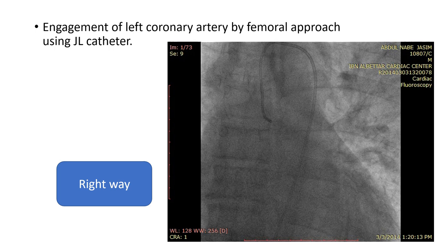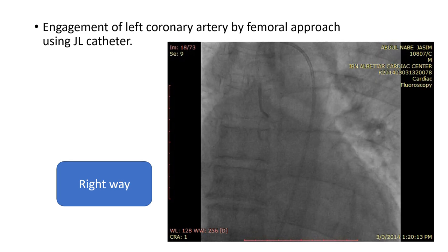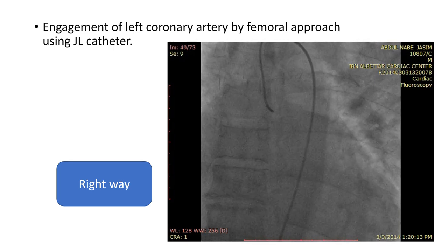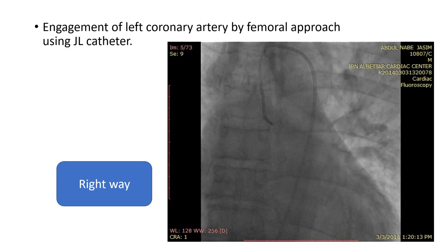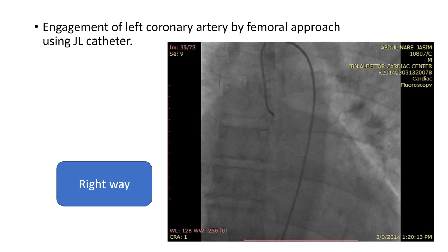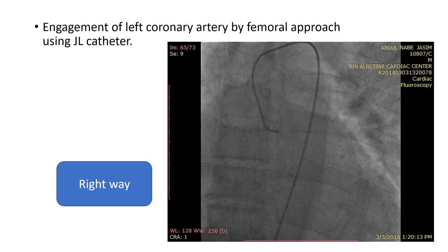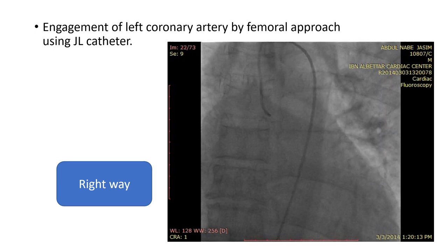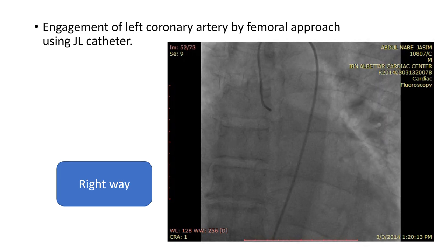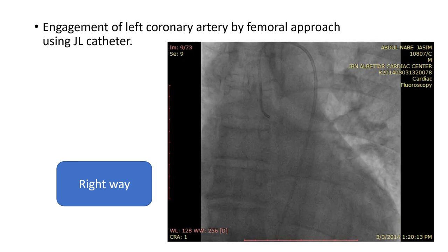Engagement of the left coronary artery through femoral approach using a Judkins left catheter. If the right catheter was chosen, as in most cases, the catheter knows its course. So after flushing the catheter, just push downward. Even if the tip does not point to the left coronary, the catheter knows its way.